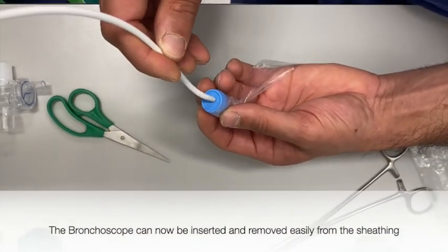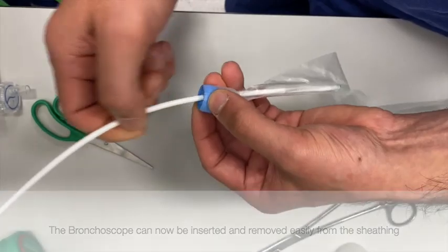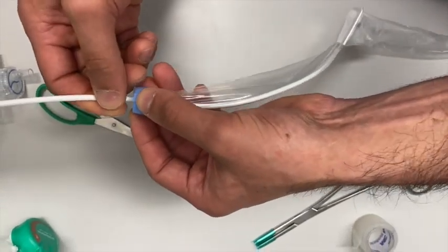A bronchoscope can then easily be passed in and out of the safety sheathing with an airtight seal around the bronchoscope itself.